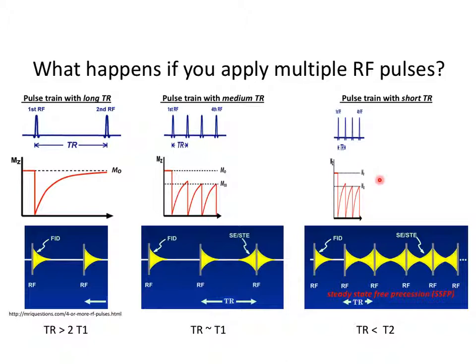And there's certain guidelines for how many watts per kilogram you can use when you're imaging a person, such that you don't heat them up over an amount that they are incapable of reducing through normal methods like circulation and breathing and stuff like that. Of particular concern are body parts that don't have great circulation. So the circulation is the thing that takes the heat away, and so your eyeballs and things like that that don't have high circulation, you don't want to heat those up. Right?